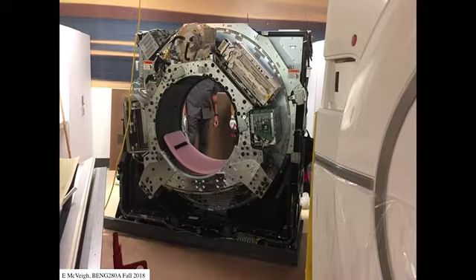So 5 hertz, right? Except at that, the stuff up here is under 80 Gs, and this is the X-ray tube. And the X-ray tube they have right now doesn't work at 80 Gs, right? You've heard of microgravity? This is not microgravity. This is megagravity. And so it sort of bends things out of shape, and so you need a new X-ray tube to get it to work at those high rates. So that's what we're waiting on.